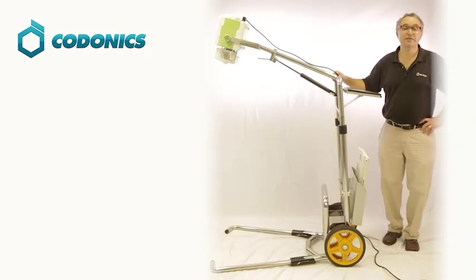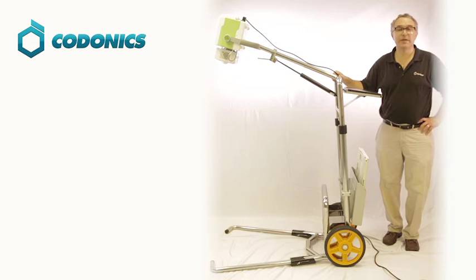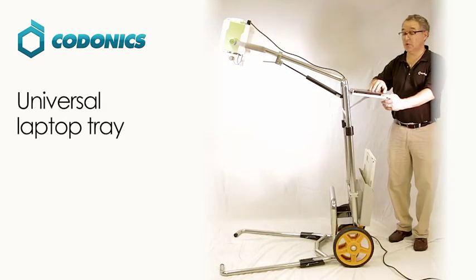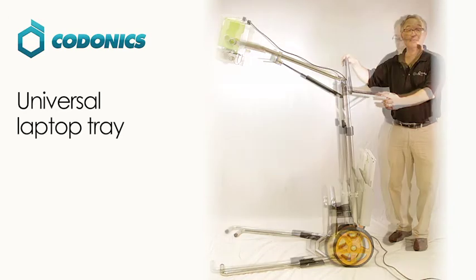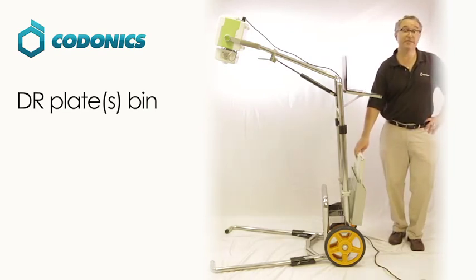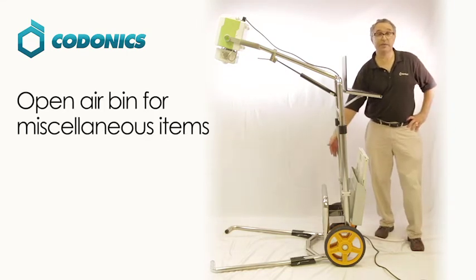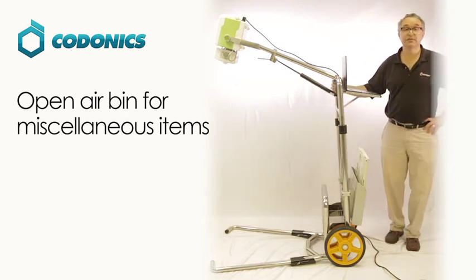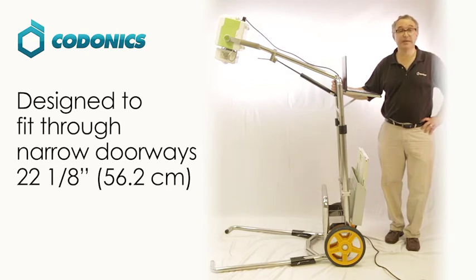Now we're going to talk about the Kodonix digital portable x-ray device accessories. There are three accessories: first, a universal laptop tray to hold your laptop in place while you're performing procedures; next, the DR bin that will hold both 14x17 and 17x17 DR plates; and lastly, another bin to allow you to store any additional items. The Kodonix digital portable x-ray cart has been designed to fit through the tightest of doorways for your procedures.